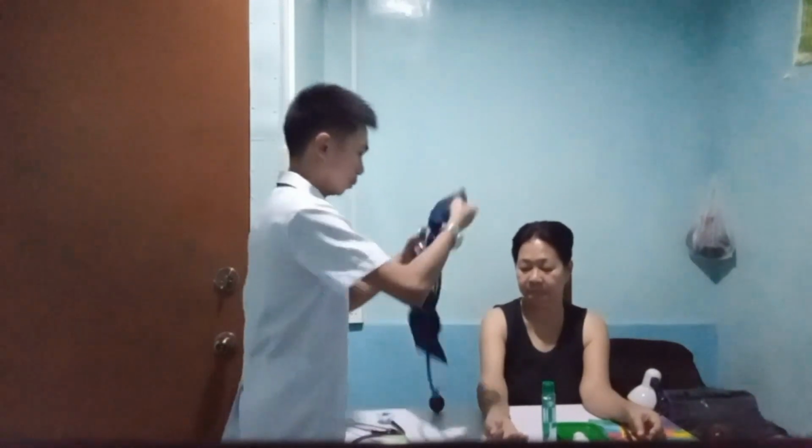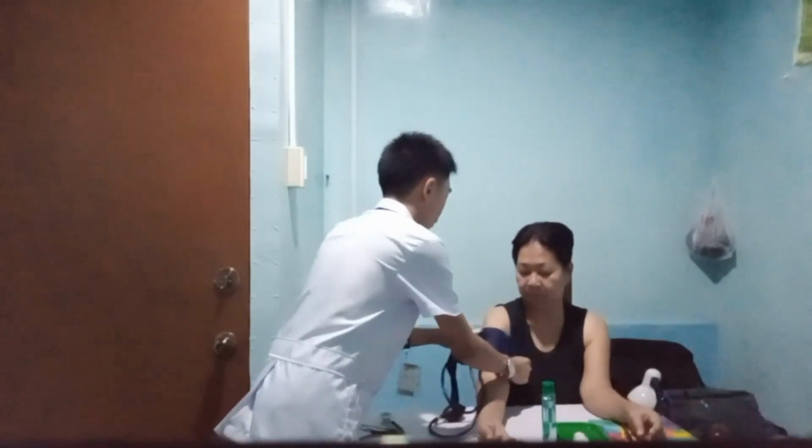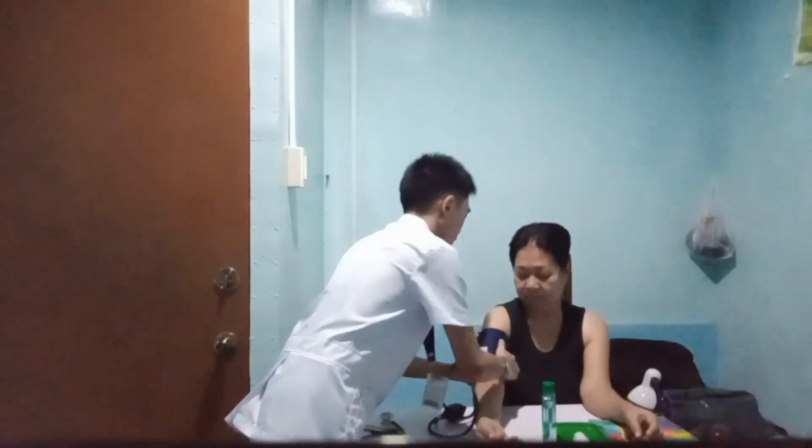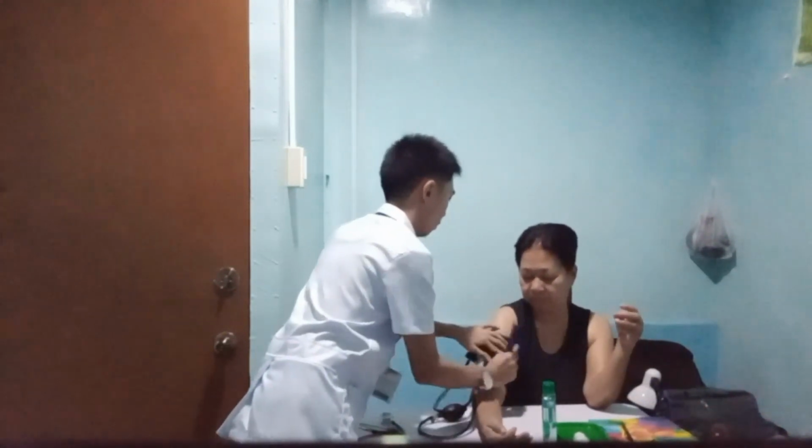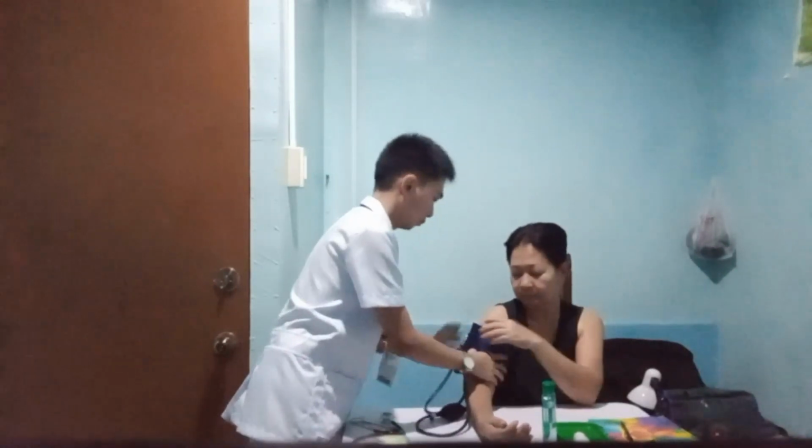So, ma'am, did you smoke or ingest caffeine? None. No. Okay, thank you, ma'am. So, wrap the deflated cuff evenly around the upper arm and locate the brachial artery.